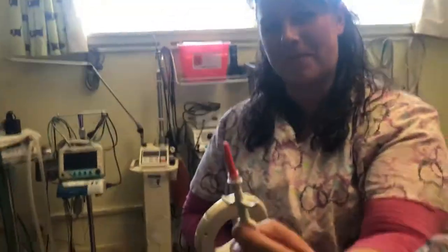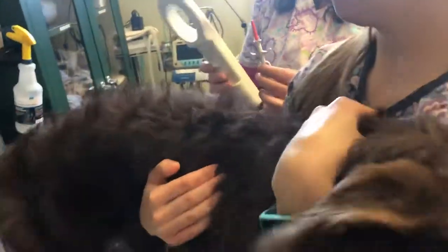That is the microchip that we use, and there's the scanner. We always scan first to make sure they don't have a chip. We always check the microchip number. The microchip goes underneath the skin in the area of the shoulder blades.